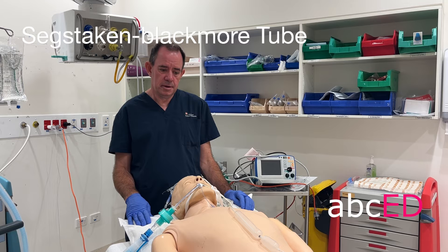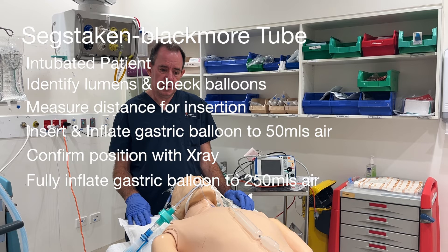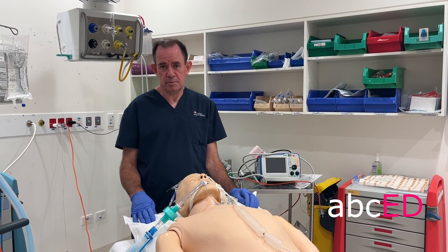Shen Staken Blackmore tube insertion summary: Have your patient intubated. Identify the lumens. Check balloons. The distance for insertion will be 50 centimetres. Insert and inflate the gastric balloon to 50 millilitres of air. Confirm the position with an x-ray. Remove the guide wire. Then fully inflate the gastric balloon to 250 millilitres of air. Anchor the tube by tying it to a 500 millilitre saline bag for weight. Then consider inflating the esophageal balloon to 30 millimetres of mercury pressure. And that's how you insert the Shen Staken Blackmore tube.